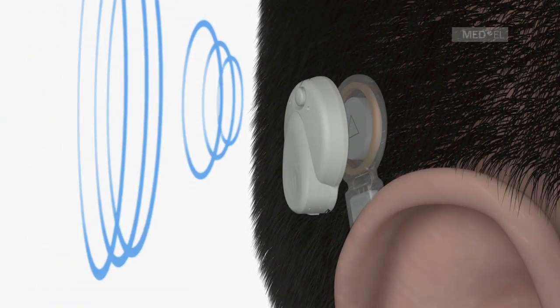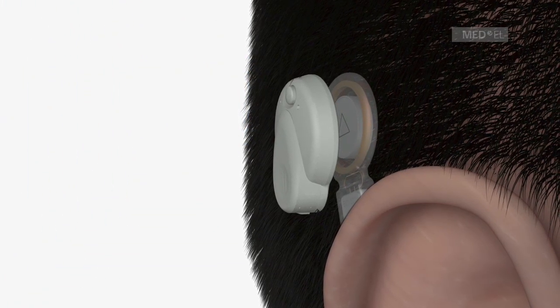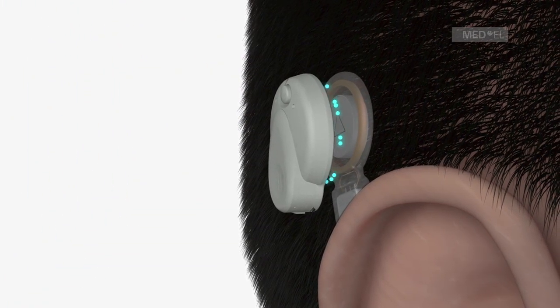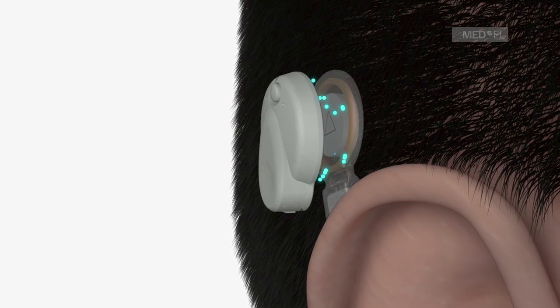The microphone of the audio processor picks up sound waves. The audio processor converts sound into signals. These signals are transmitted through the skin to the implanted part.